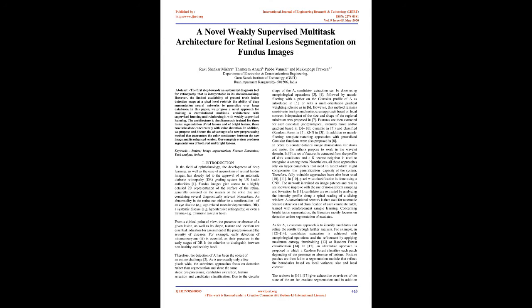In addition, we propose and discuss the advantages of a new pre-processing method that guarantees the color consistency between the raw image and its enhanced version. Our complete system produces segmentations of both red and bright lesions. Keywords: retina, image segmentation, feature extraction, task analysis, lesions.